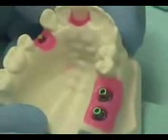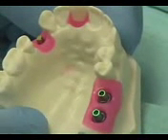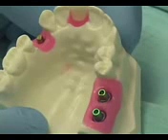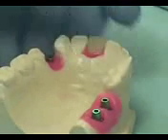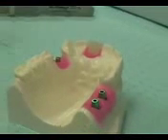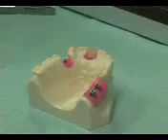For our patient, we now have our regular neck abutment placed and our two wide neck abutments placed. The next thing we want to do is to take a polyvinyl impression of our implant abutments in place.